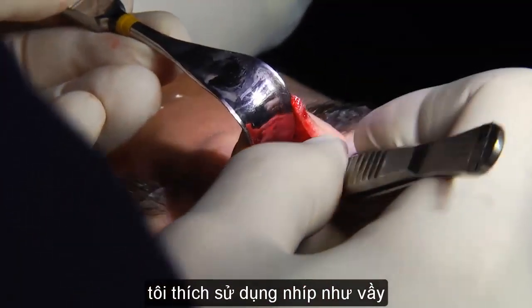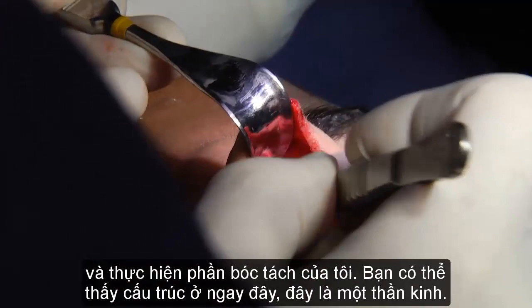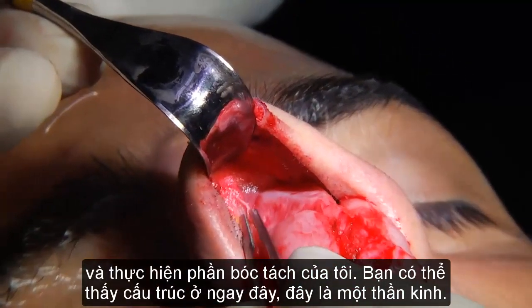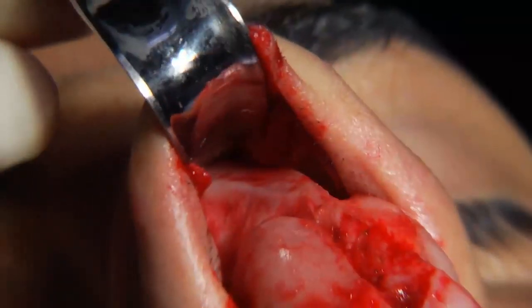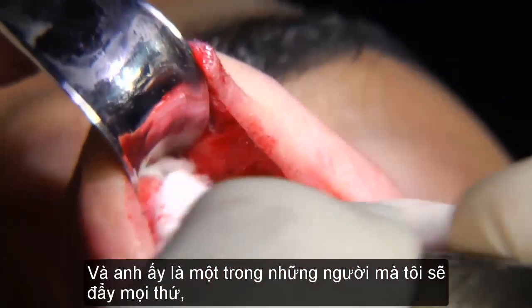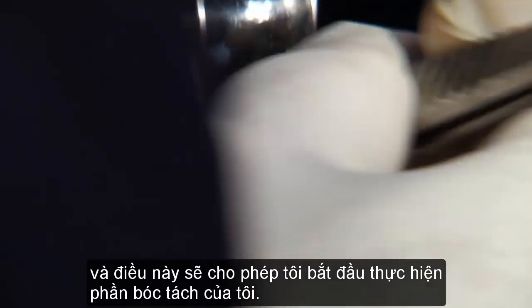I like using my stout Debakeys and just do my dissection. Now you can see this structure here, it's a nerve. It's always kind of present. And here's one of those in which I will actually push things. And this will allow me to start my degloving.